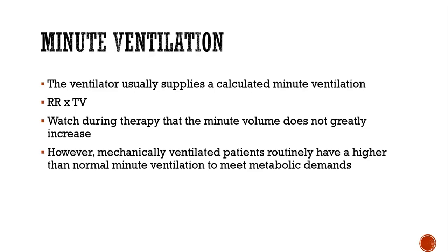Okay. So minute ventilation, the ventilator usually supplies a calculated minute ventilation. It's respiratory rate times tidal volume. So we watch during therapy that the minute volume does not greatly increase, like if the patient is on the vent or a CPAP, BiPAP, whatever it is, that it doesn't increase.